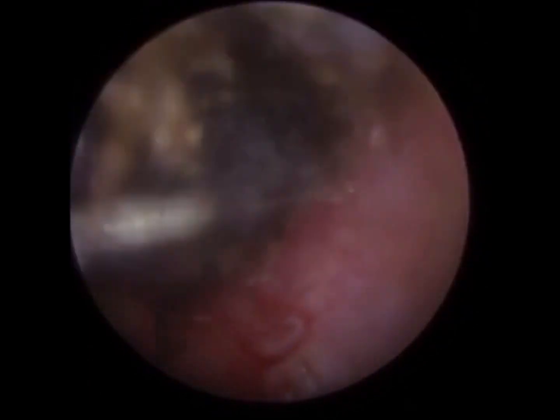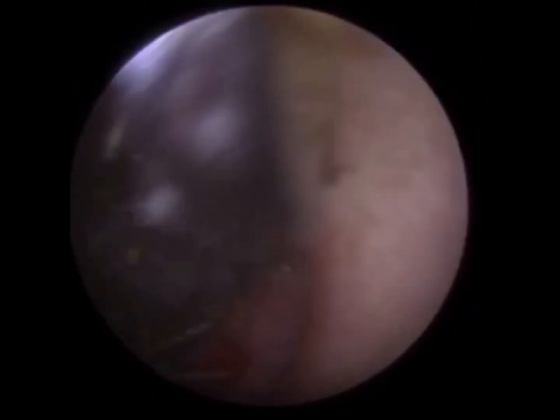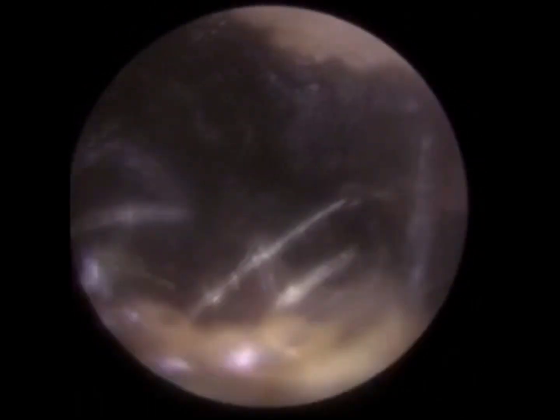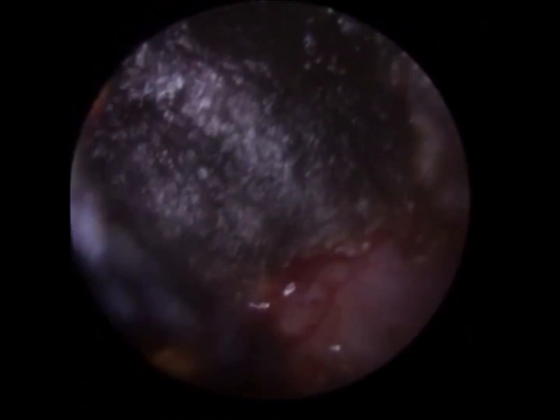Again, just going with the Jobson horn, trying to elevate this forward. You can see just at the base there's a bit of redness, a bit of soreness. It wasn't active bleeding, you'll see that in a moment. It just seems like a bit of bruising, blistering. And again, that could have been because we just made contact with the Jobson horn.